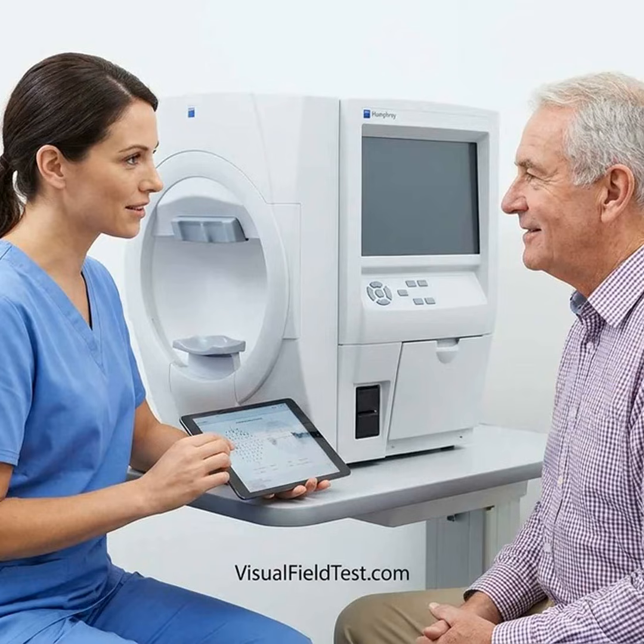In a 6-month study of the eye-catcher tablet Perimeter, 20 patients completed monthly home testing with 98% adherence. Home results correlated well with clinic results, and the median home test duration was 4.5 minutes. Adding home tests reduced measurement variability in most eyes.